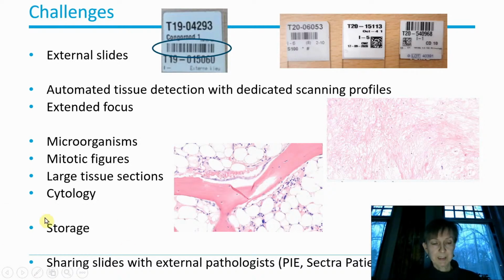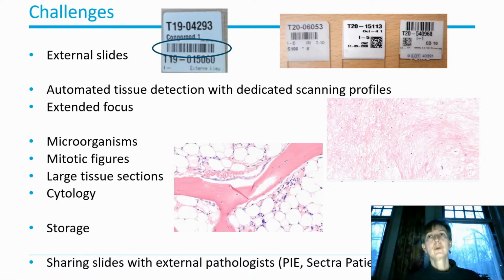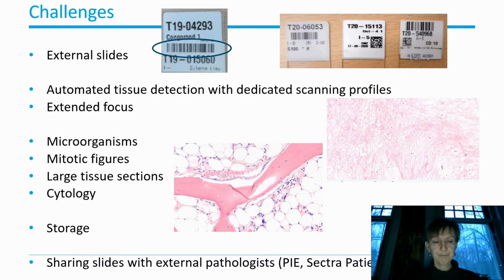Well, what I already discussed is that our storage is still very limited, because these are such huge data to store that we still do not have the capacity to keep all the images, which will of course be the goal eventually. And the last challenge is sharing the slides with external pathologists.